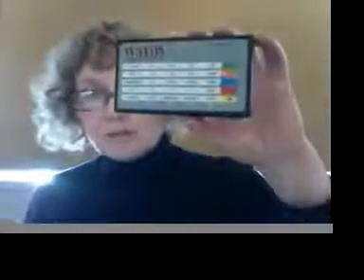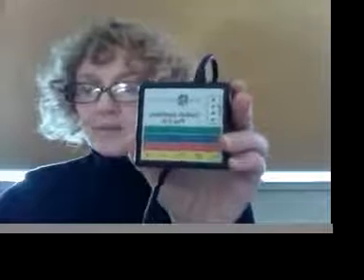It's called a switch interface, and here's one example of a switch interface, and here's another example of a switch interface. And switch interfaces plug directly into your computer, and they replace the functions of the keyboard, or many of the functions anyhow. First, with this particular device, you have to plug in the connector cable like that, and then on the other end you plug into your USB port.